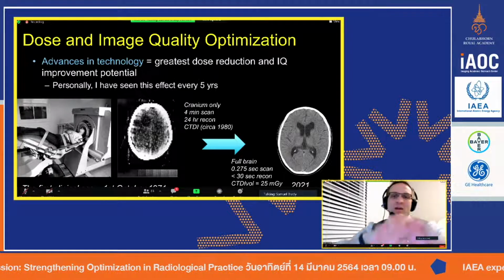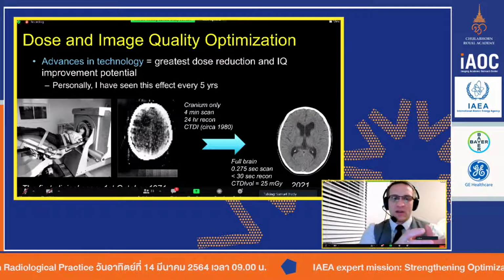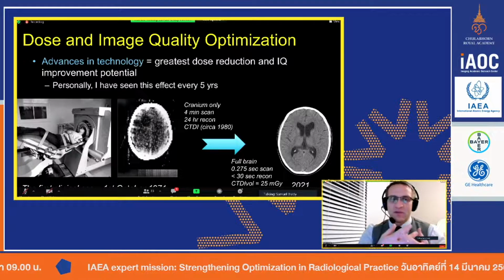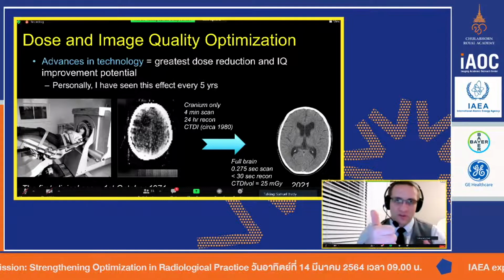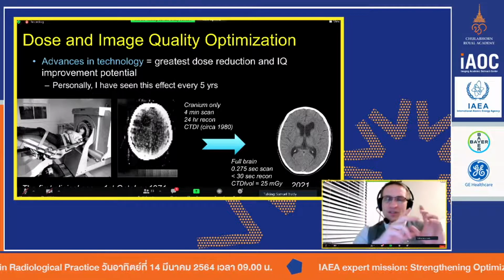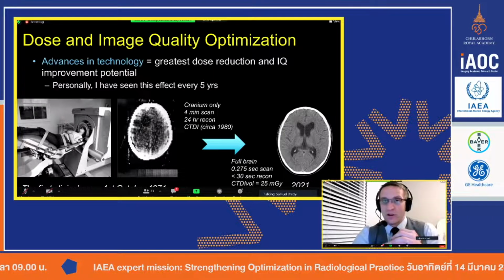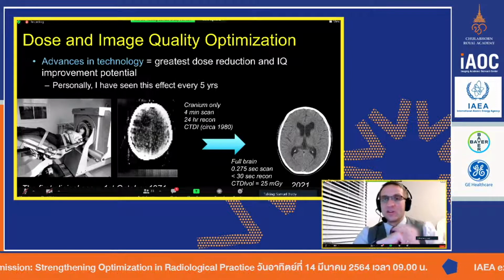All right, so, we talked about image quality, we talked about how when new technology comes out, we should constantly be reassessing, correcting for and using that new technology for improving image quality and potentially reducing radiation dose where possible. And I demonstrated that over the last 10 years, we in the US have been acquiring more CT scans in our medical population than we did a decade before. And we've been doing it at lower doses.